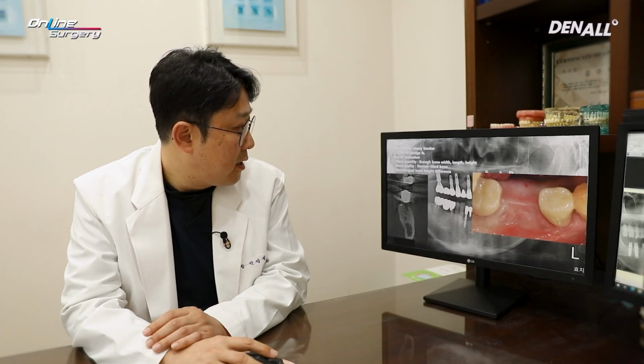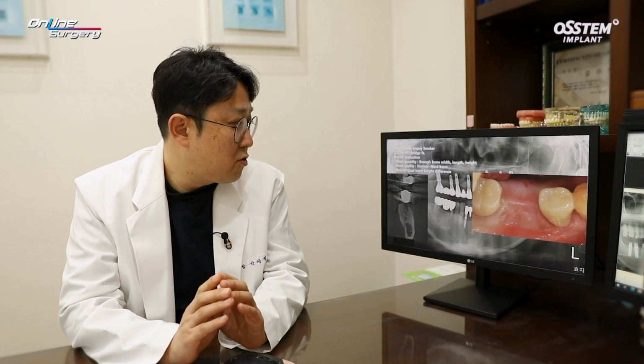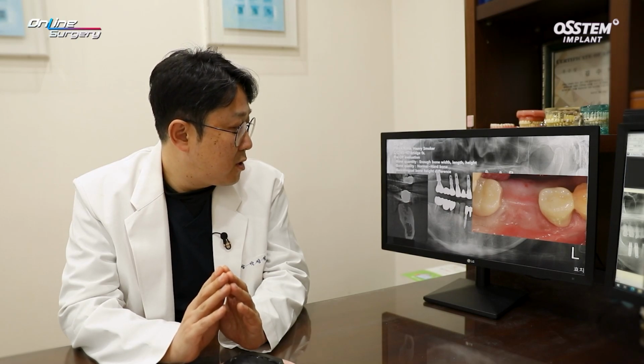However, on the buccal side and the lingual side, the bone levels are different. So the depth of implant placement needs to be considered, whether we will place the implant a little bit deeper or allow the implant thread to be exposed on the crestal side.